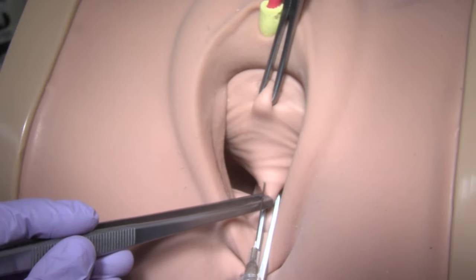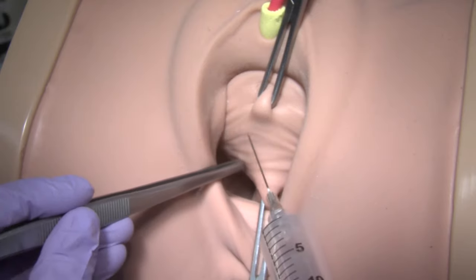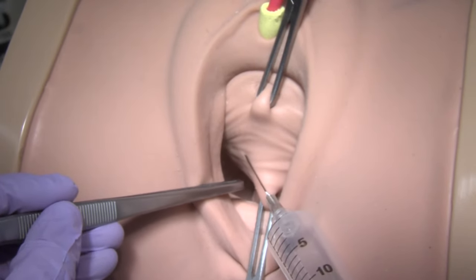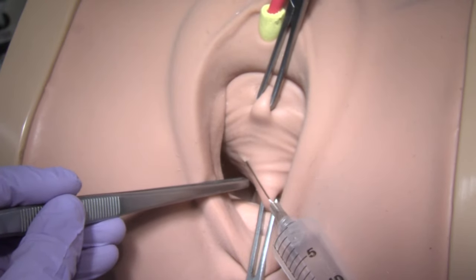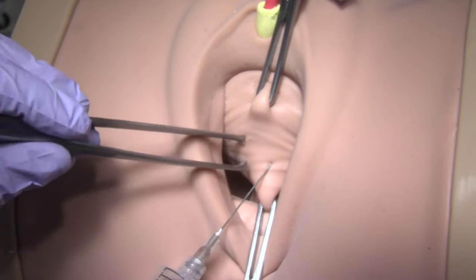Use 20 units of Pitressin and 20 cc's of plain half-percent Marcaine in 100 cc's of normal saline mixture. I typically use 20 cc's of the mixture for the hydrodissection.